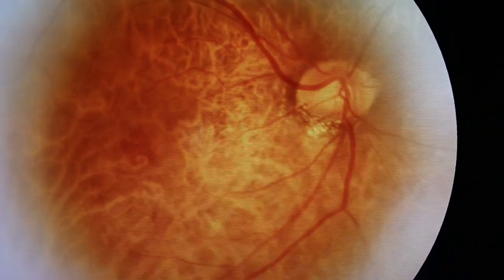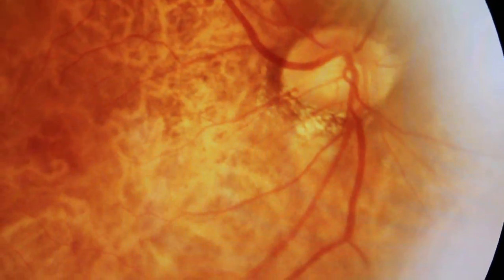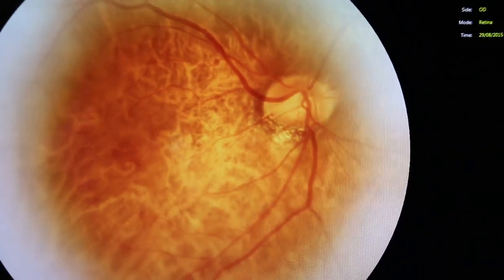This is a better blood vessel picture here than the right eye — clearer and sharper. But we cannot tell you the left eye is a worse eye and the right is a better eye, because we have cataract, so the picture is not very well taken.